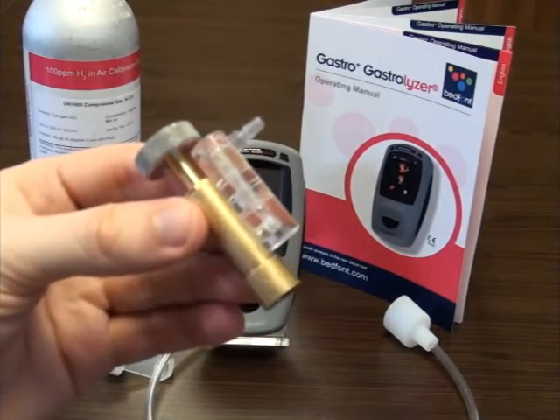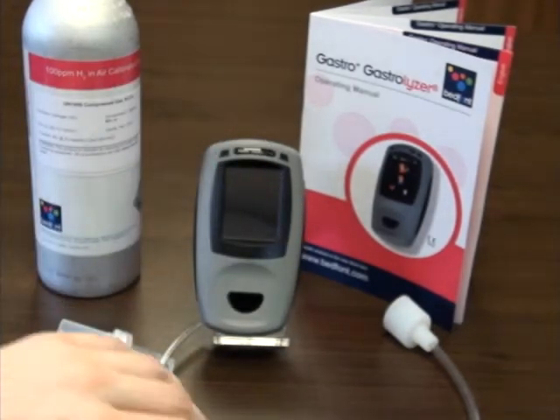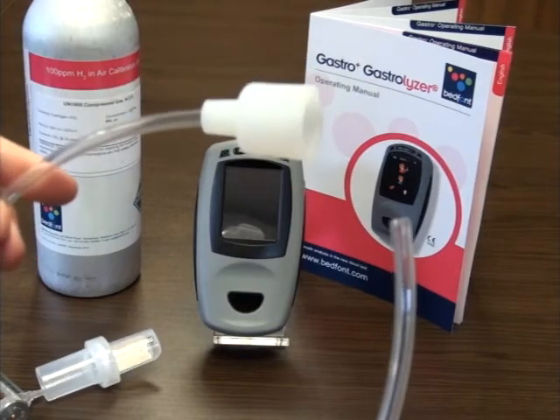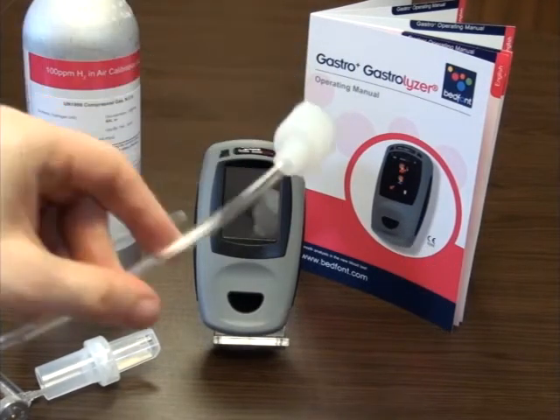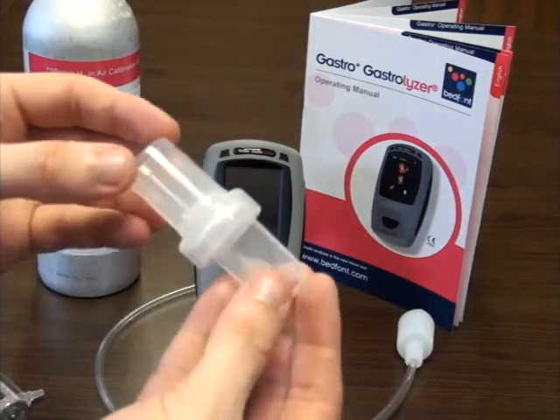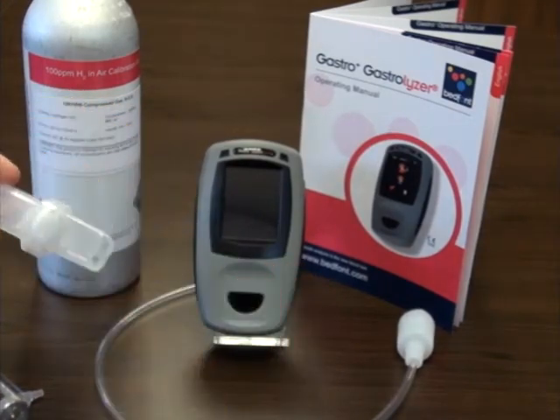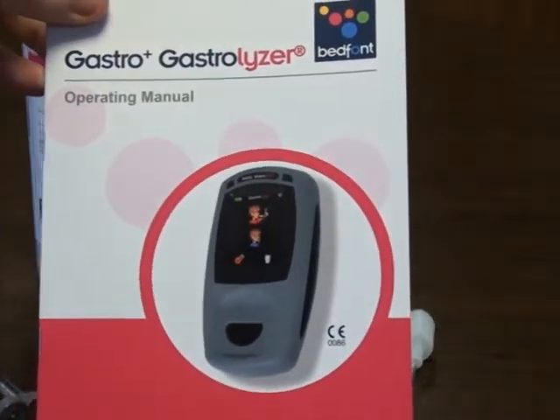Also included are a control valve and flow meter, calibration tubing, a D-piece, and the manual for reference.